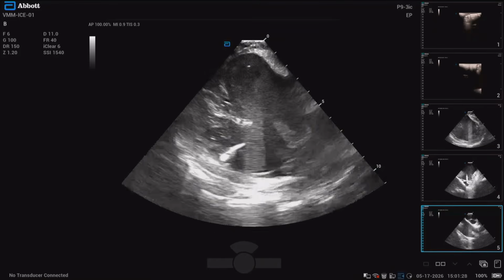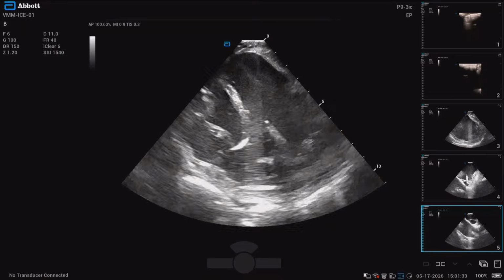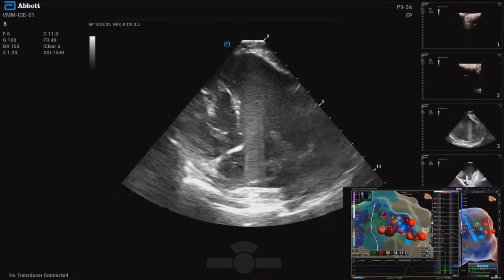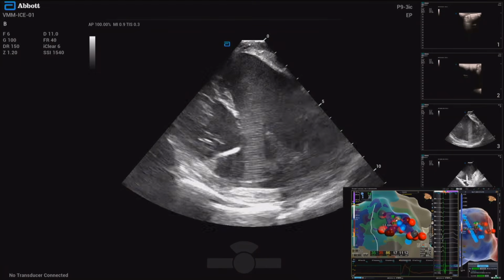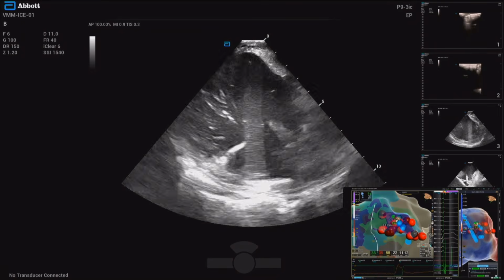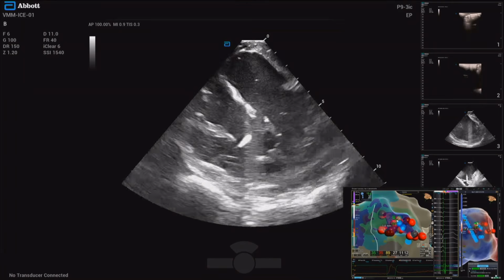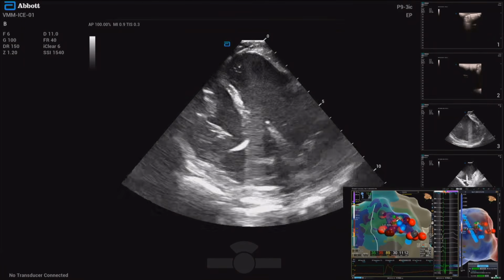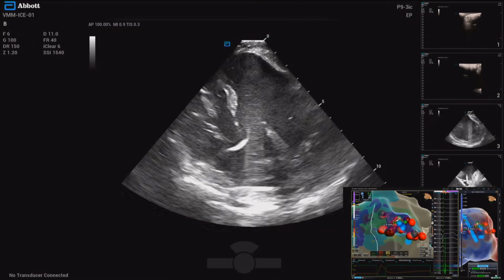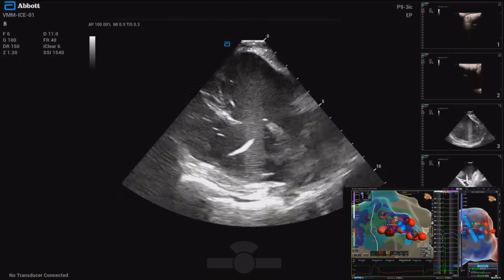So maybe you can see that we are ablating something on a thin wall. Here it is very thin, very basal, but we are more on a thicker tissue. On the right hand of the fan, you can see the centimeters. So it's more than a few millimeters. It's actually up to like 6, 7, 8 millimeters, the tissue thickness here. If I rotate slightly, just under the valve, you can see that the thickness is really small, but we are not there currently. So I believe there's a lot of information that you can combine and use during the case. Can we switch back to the EnSite map?